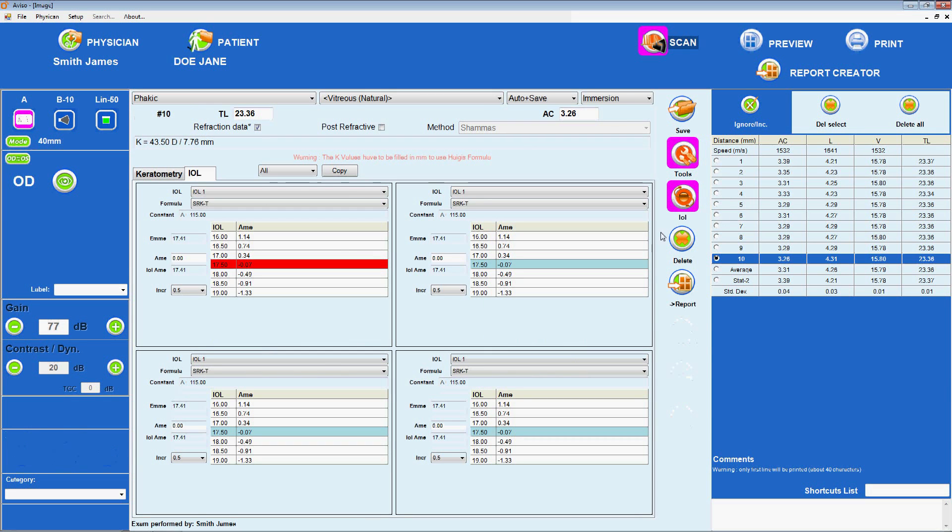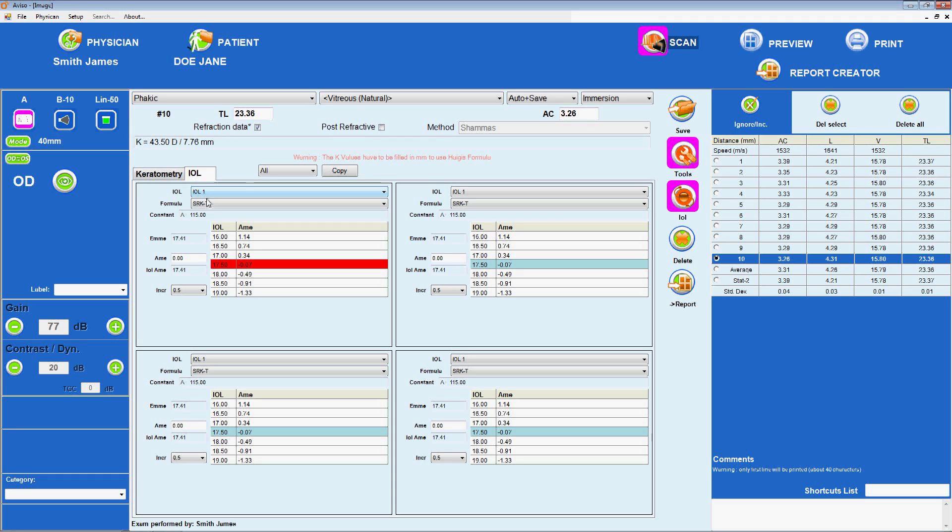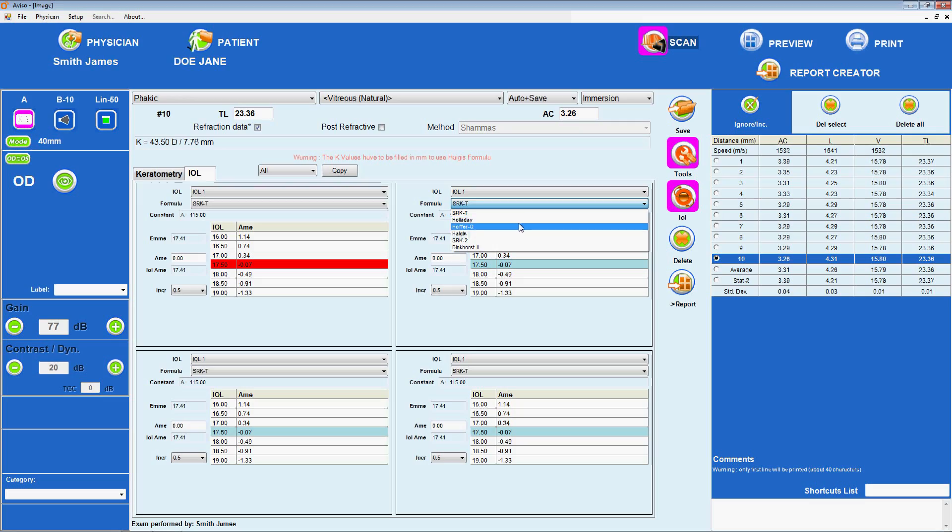A constants provided by IOL manufacturers or personalized for the individual surgeon may be entered and included. It is important to note and use the correct A constant for each IOL, as manufacturers commonly provide both an ultrasound A constant and an optical A constant to be used with optical biometers such as the IOL Master.